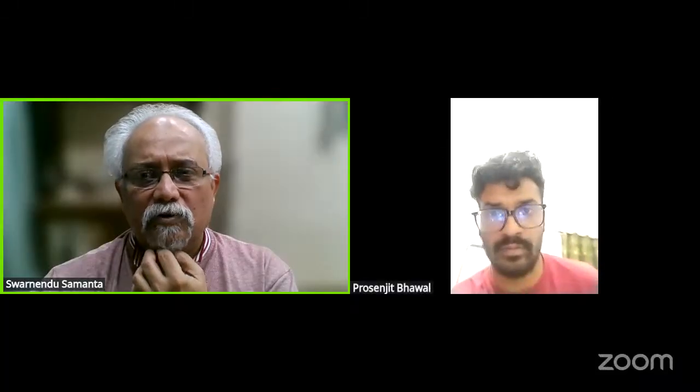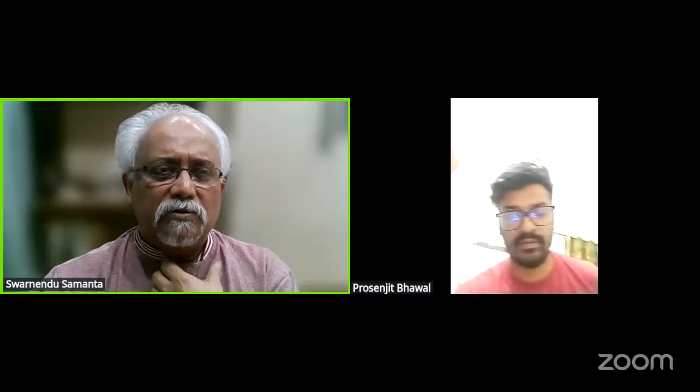Thank you, sir. My regards to John, sir, my dear friend Janki, and all those who have joined. Today we are going to discuss how to present the X-ray during the viva exam, during the MS or the DNB, because there are certain protocols and the examiners will like to hear whether you are following the protocols, yes or no. They don't jump into diagnosis. They are not giving very extraordinary or atypical X-rays during the exam. It is all very typical. Probably you have seen them during your 3-year course.